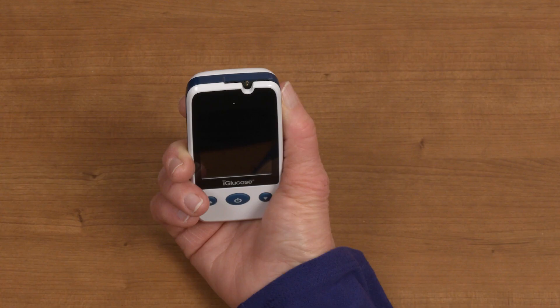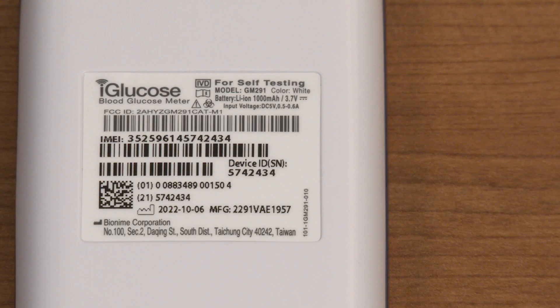At the top of your iGlucose Meter is the test strip port, where you will insert a test strip right before each glucose reading. We will cover how to insert the test strip and take a reading later in this video. On the back of the device, you will find important information like the device's IMEI number. This will be important if you experience any technical issues and need to call our customer service team.